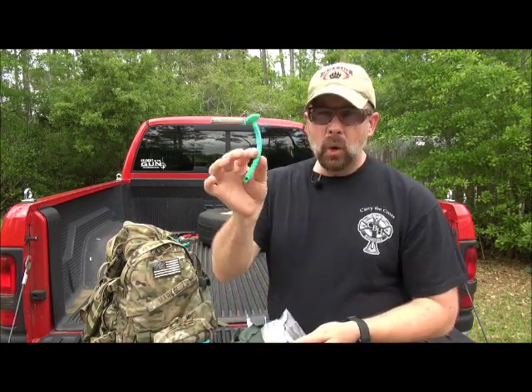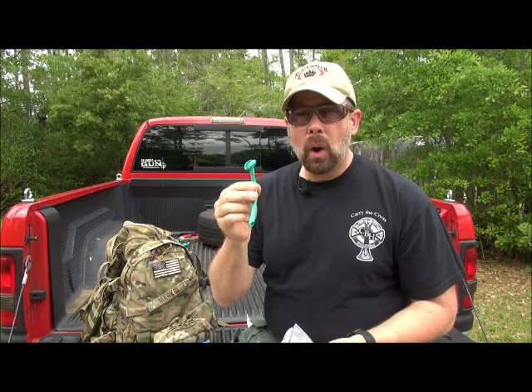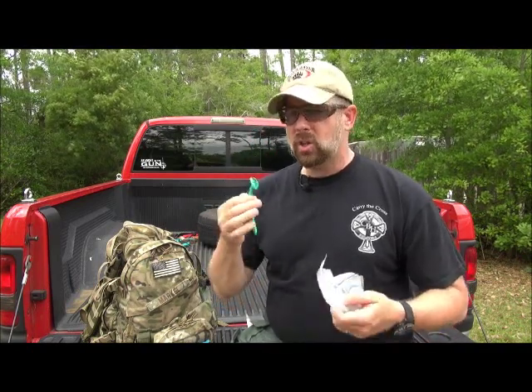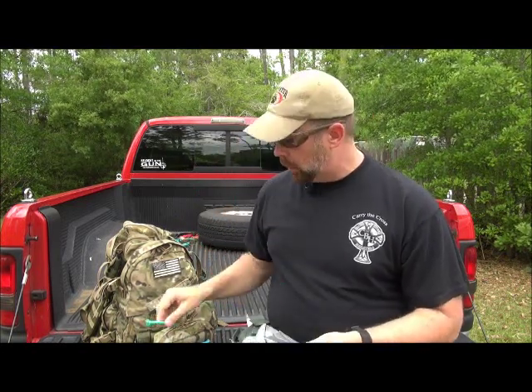Well, I've got my nose hose, my nasopharyngeal, or my NPA. This maintains an open airway on who? On conscious patients that are screaming, my arm, my leg? No. This is for unconscious people to make sure that they maintain an open airway. And what's the last thing that will kill you?